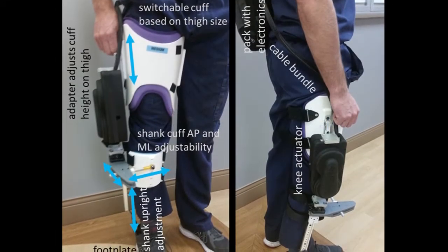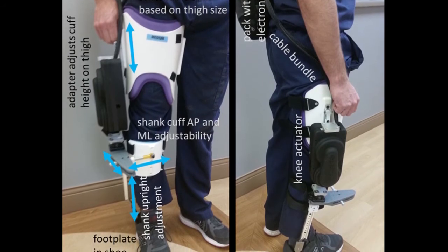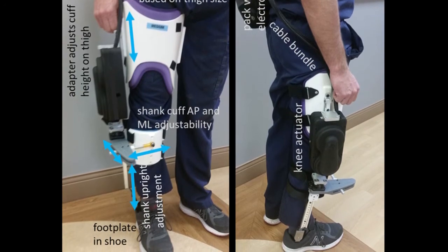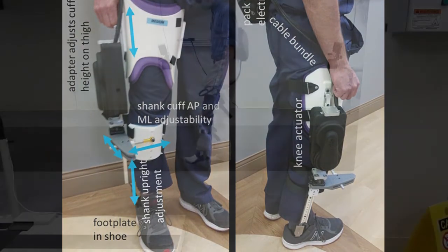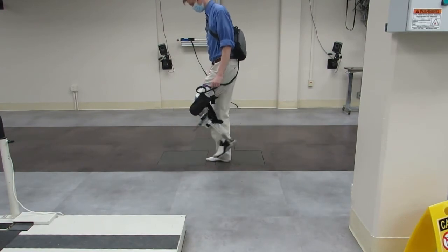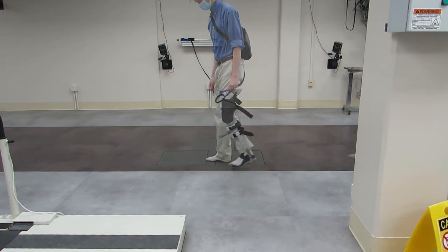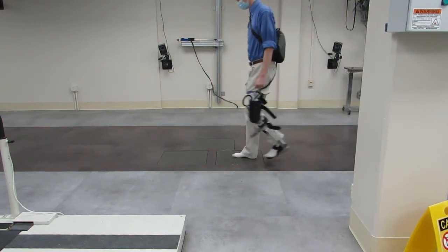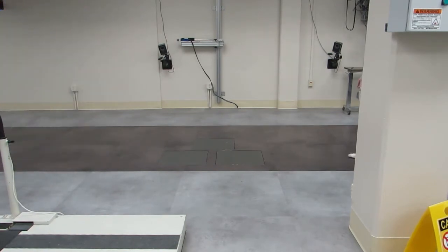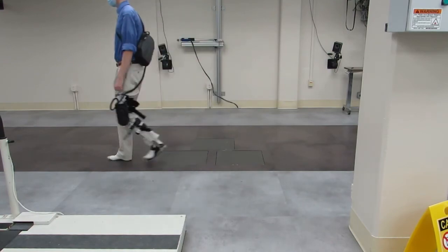Taking advantage of the modular nature of the CPWS system, we recently adapted it for unilateral assistance for stroke survivors. This version incorporates an exoskeletal knee and surface stimulation. Stimulation is applied to generate ankle dorsiflexion and plantar flexion, as well as knee extension and hip flexion, while the motor acting at the knee ensures flexion for toe clearance in swing and knee stability in stance. In this way, the stimulation enhances walking speed and the exoskeletal knee ensures safety.